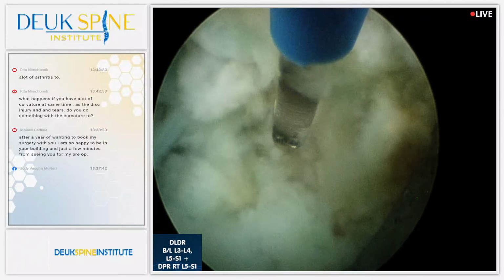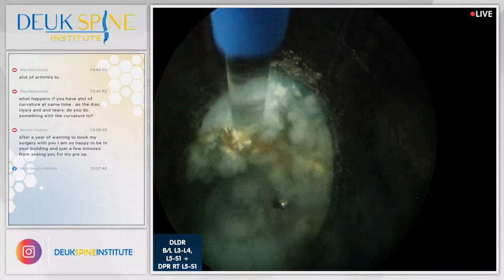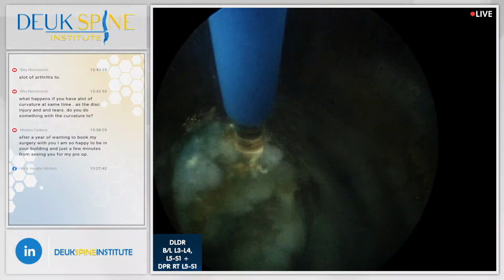All right, sometimes the laser will hit that, and it'll melt the two pieces of metal together in the needle, and we won't be able to take the middle out. And it's basically welding the metal.